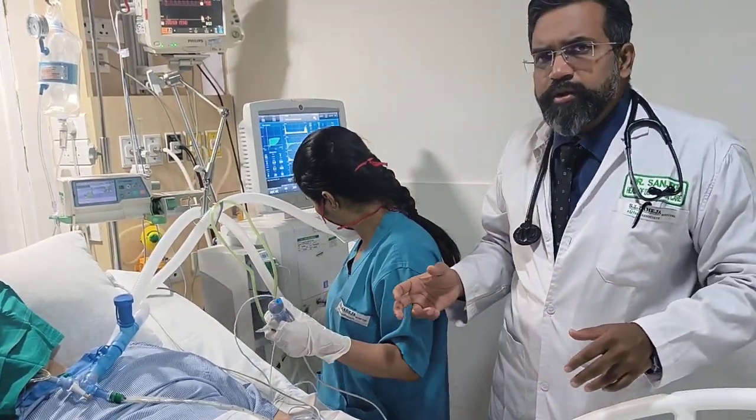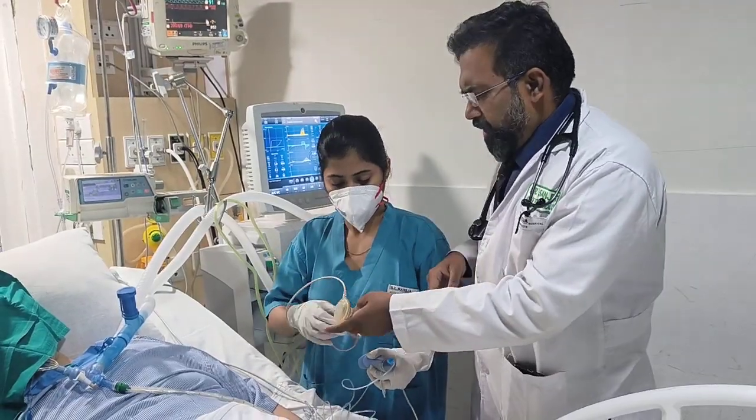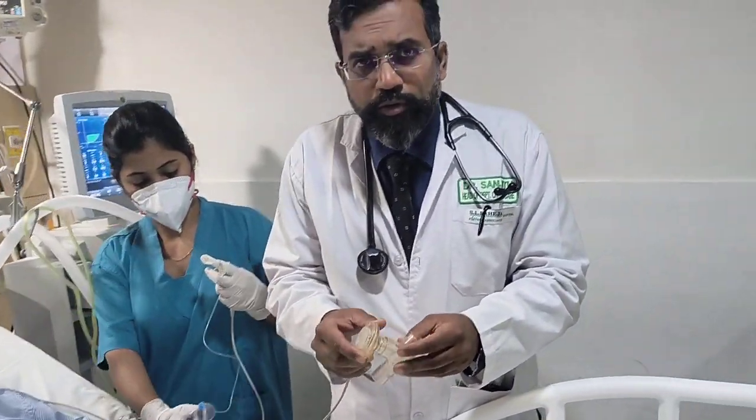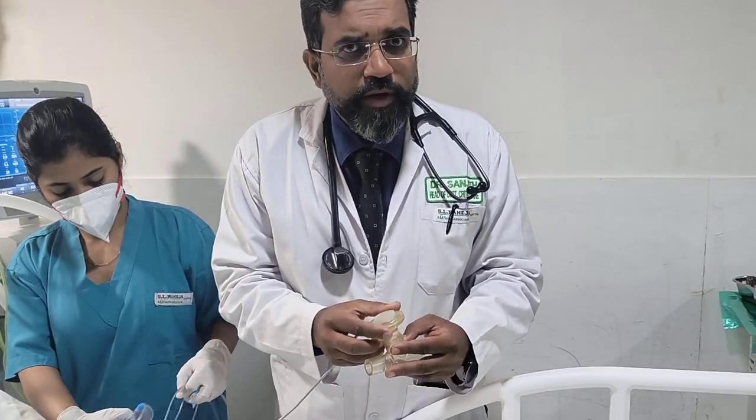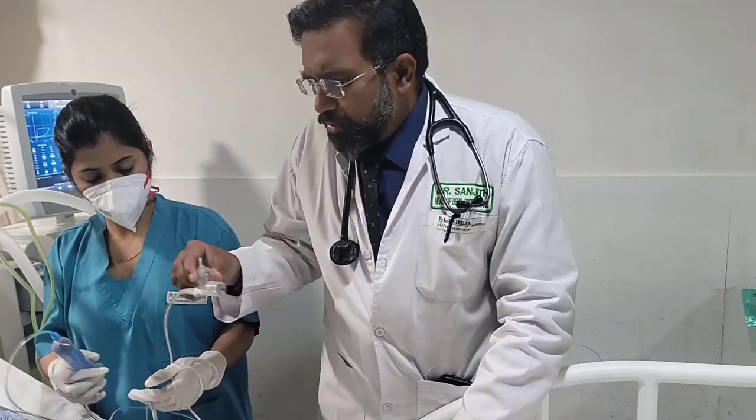Continuous nebulization is something we need to do when the patient has a severe exacerbation and is admitted to the ICU. This is the Aerogen Pro. This cannot be used for continuous nebulization. What we need to use is the Aerogen Solo, which is this one. Aerogen Solo looks like this.